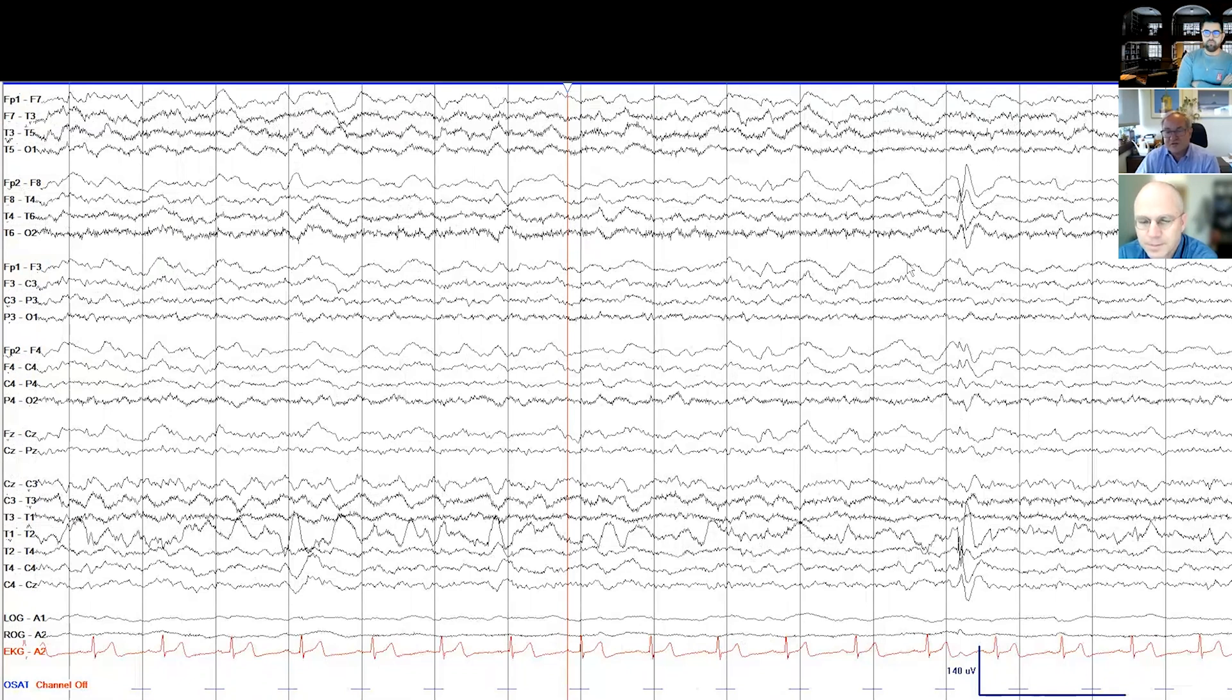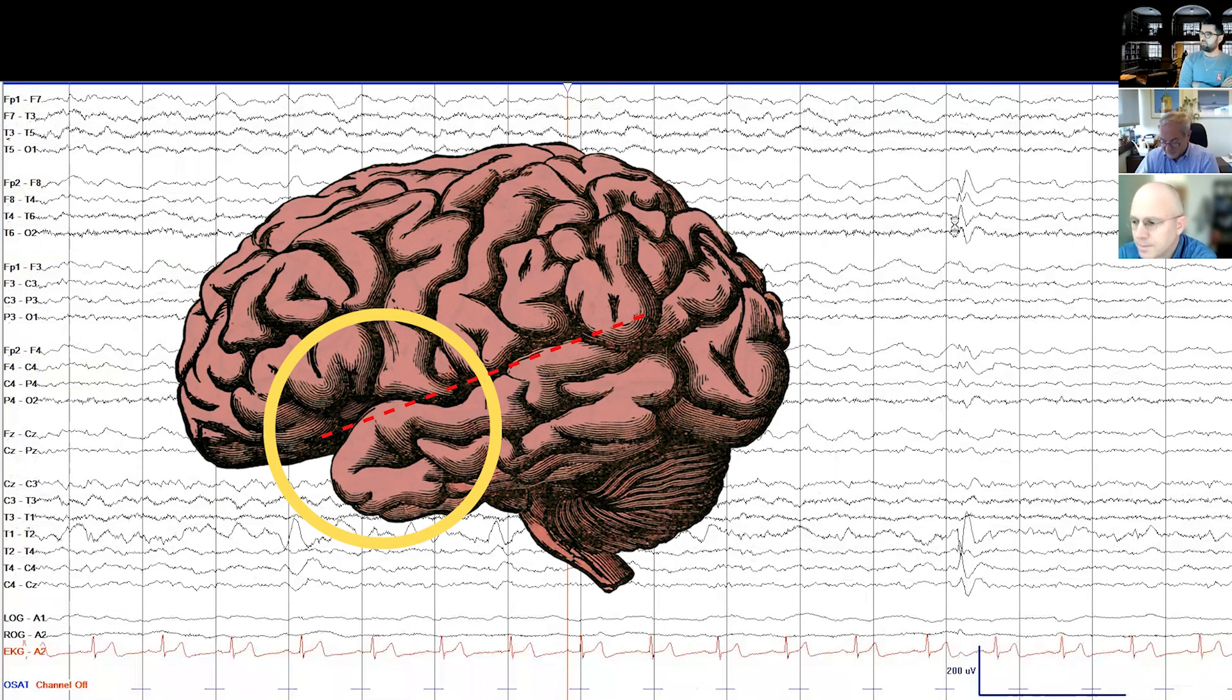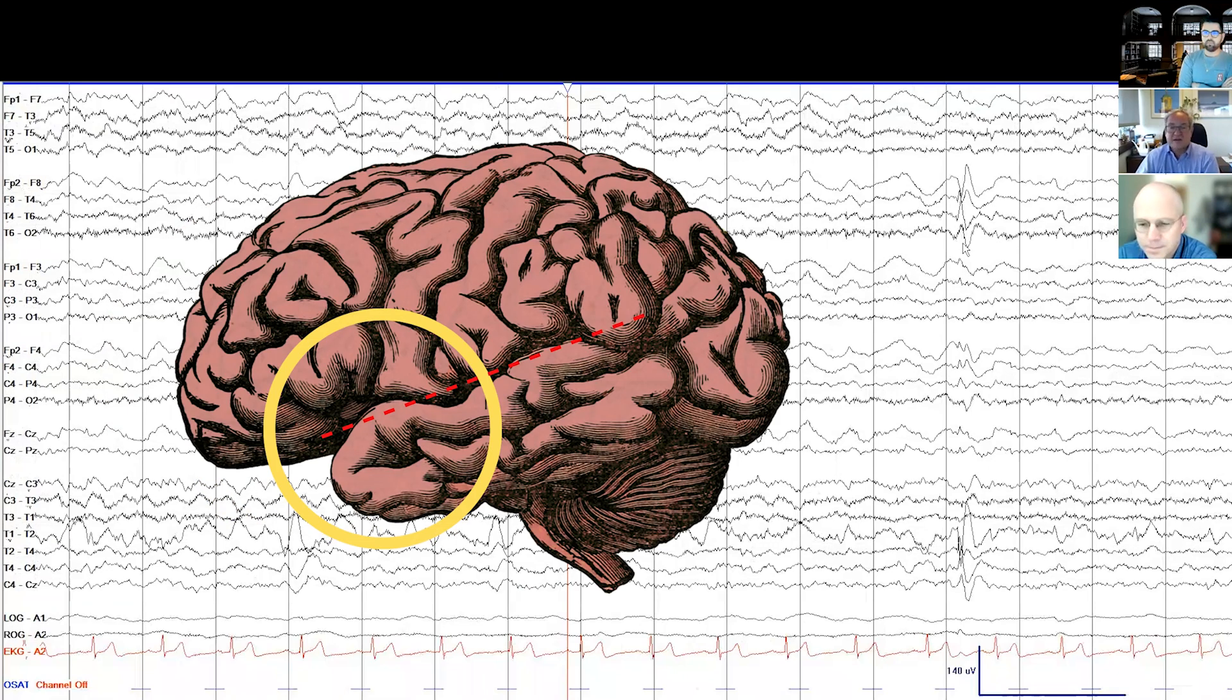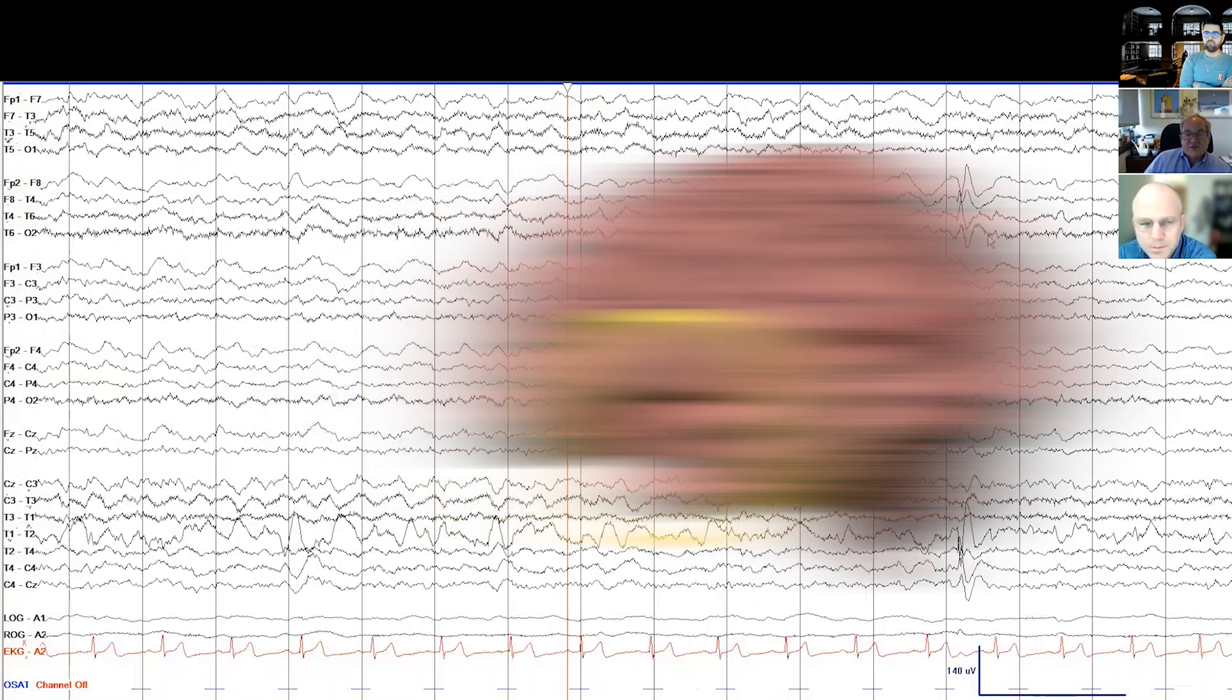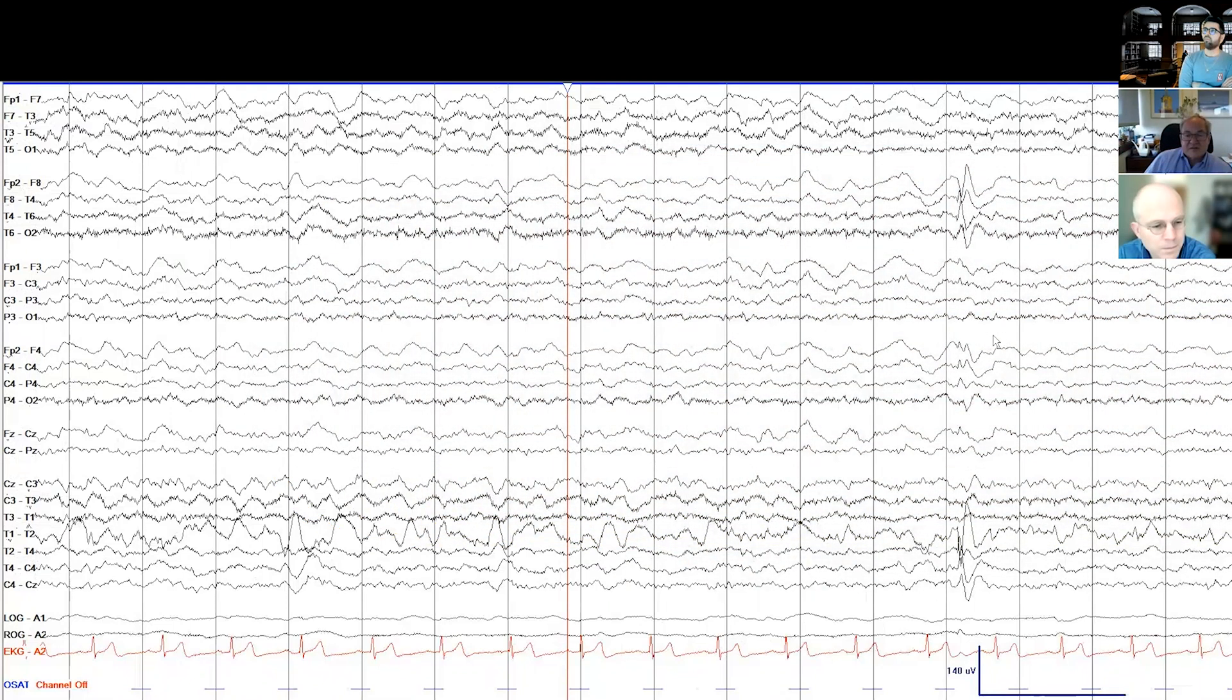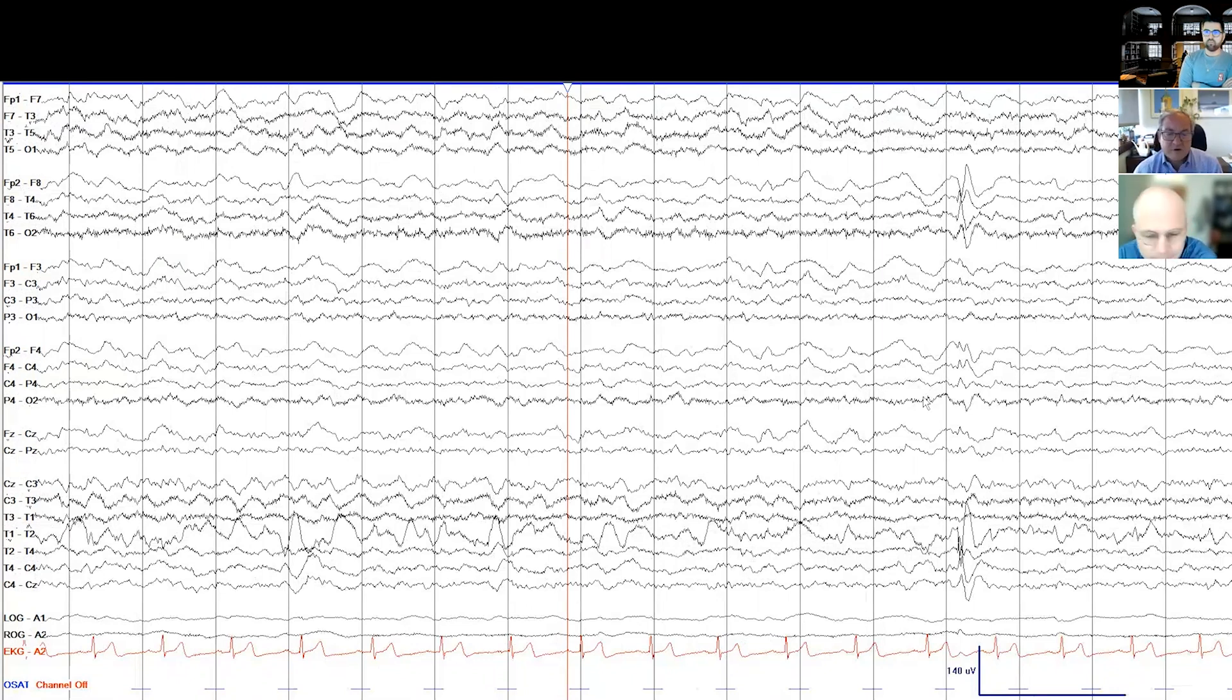We always think of F7 as an anterior sylvian electrode, which is a way of saying that it's a little bit ambiguous whether it's temporal or orbitofrontal. But the majority of these look temporal and they certainly behave like temporal spikes. His seizure phenomenology is quite temporal also. We ended up recording some seizures from him during this admission.